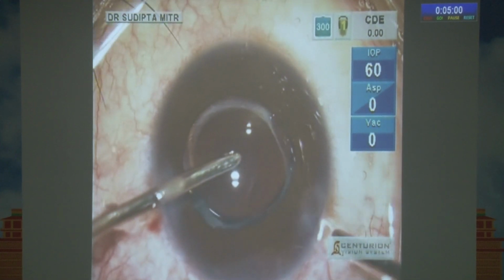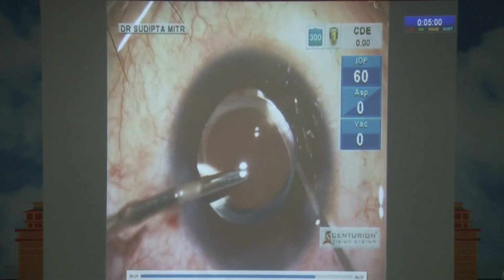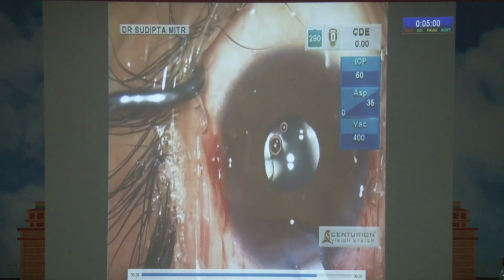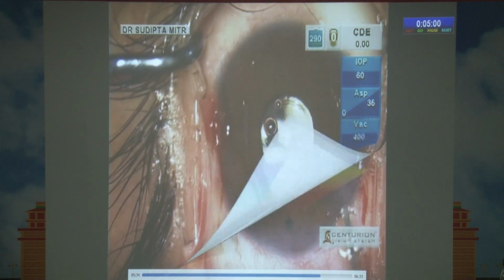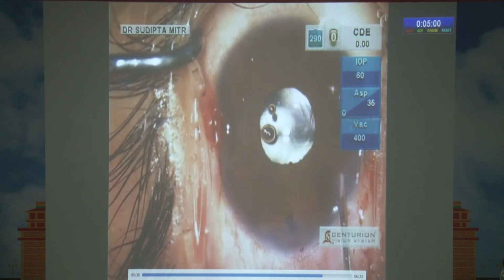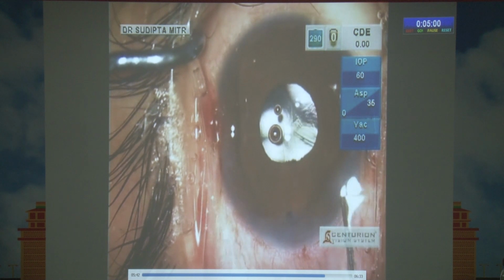So, and then asking the patient to look at the Purkinje lights, I waited for a minute to ensure that the lenses were properly in position. I did a small PI, of course, a peripheral iridectomy, just to make sure, because I had 2 IOLs in the eye. And then sealed the wound with hydration. The procedure looked good to me.